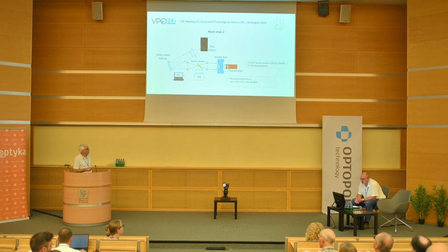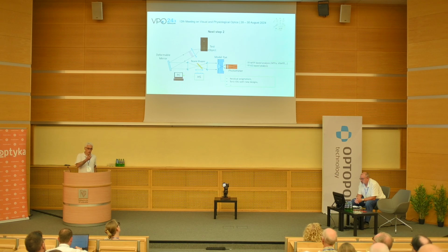The interesting thing now is what happens when there's residual astigmatism, how we will see better or worse, and what's happening with these new toric IOLs with new designs.